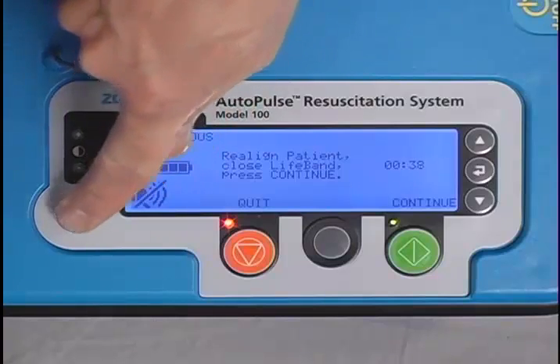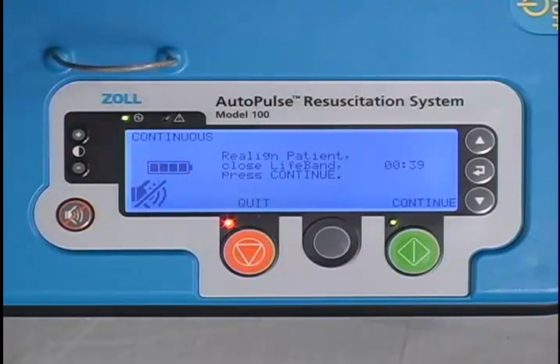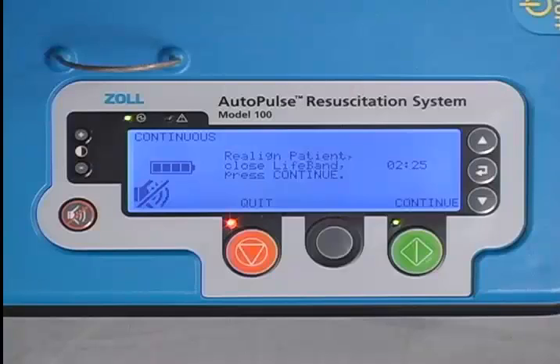The Tone Mute button mutes the pause alert tones for 30 seconds only. After 30 seconds, the pause alert tones will resume sounding.